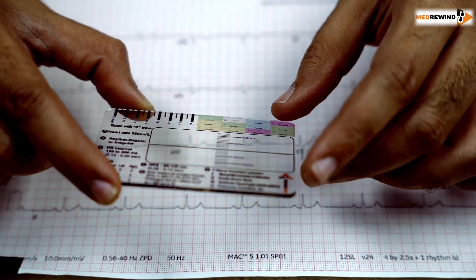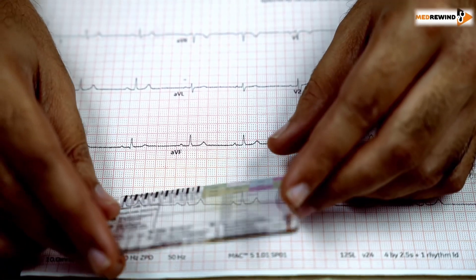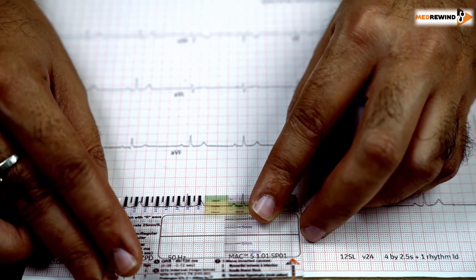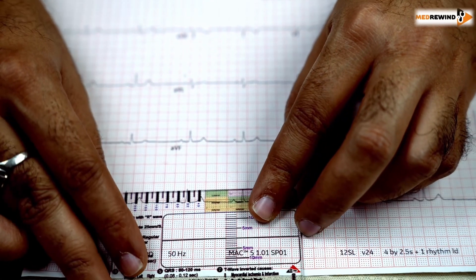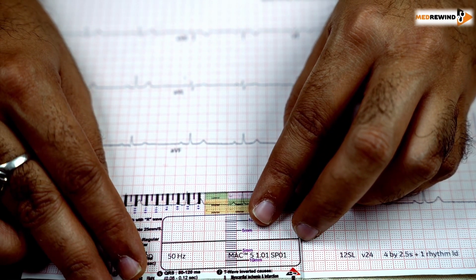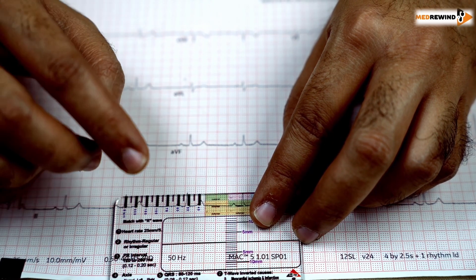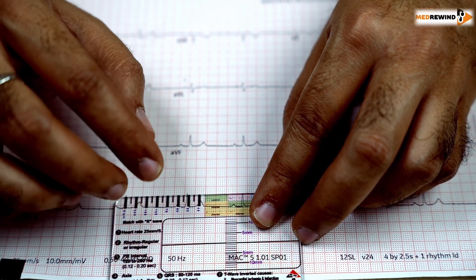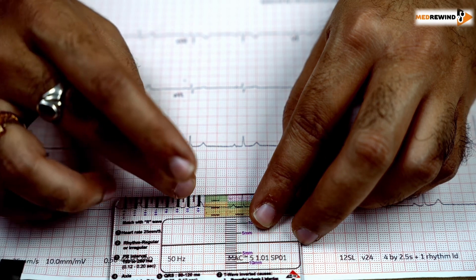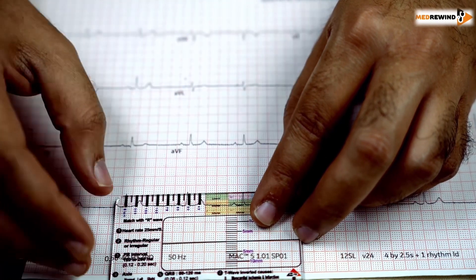The first step is to match the R wave with the start complex. You match it with the R wave and see where the second R wave is coming. It is something close to 50, so by this we can understand the heart rate is between 50 to 55 — it's around 53.